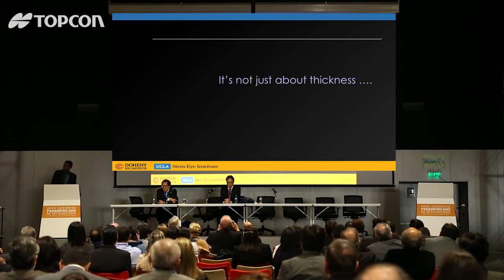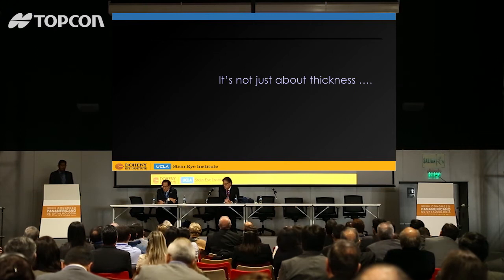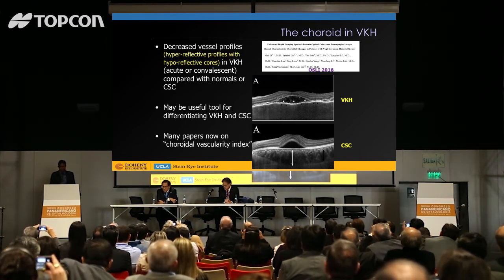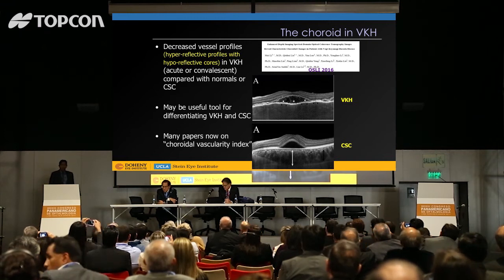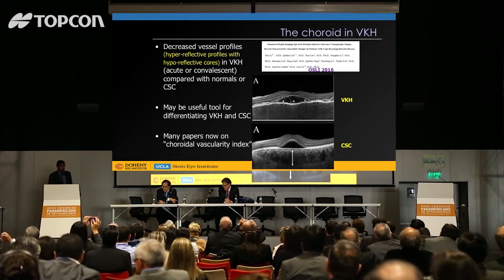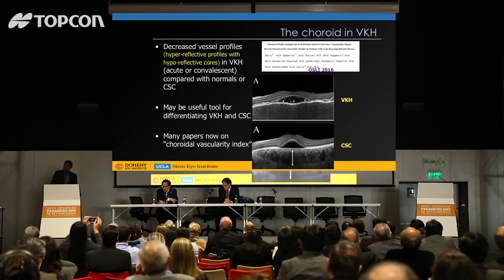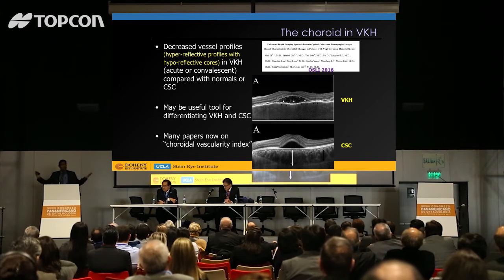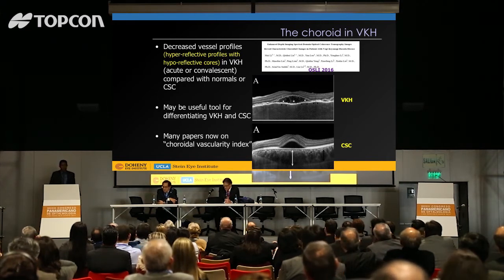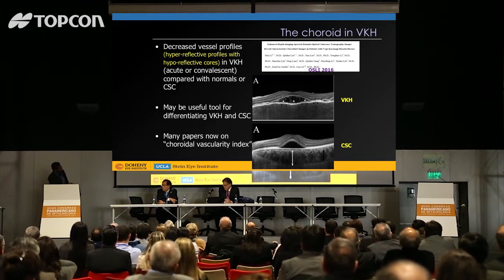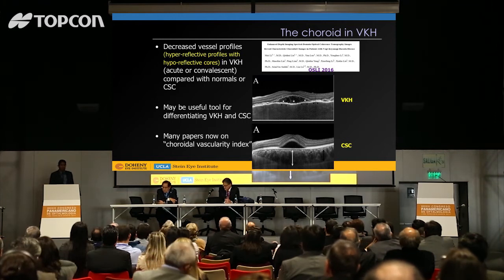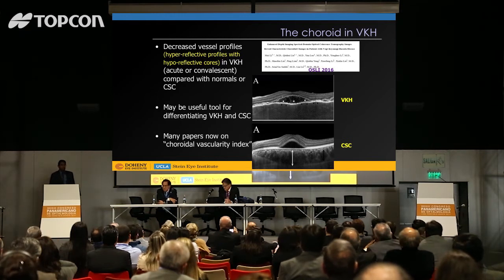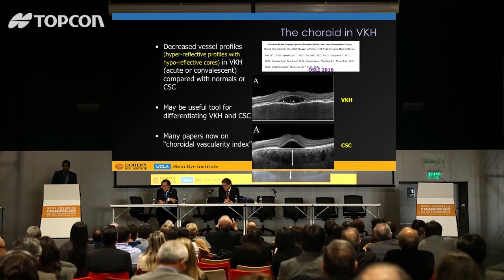One thing I want to emphasize is that there's more information in the choroid than just its thickness. We published a paper last year in collaboration with one of my fellows at Zhongshan Ophthalmic Center in China. Many of us have seen patients confused between Harada's disease and central serous choroidopathy — both can feature thick choroids, and you don't always see obvious inflammatory signs in every Harada's patient. The treatment is very different — you don't want to give a central serous patient steroids. The choroid looks quite different in these two entities. You can recognize the vessel profiles well in central serous patients, but they're often obfuscated and difficult to differentiate in Harada's disease, probably reflecting inflammatory infiltration. This can actually be measured quantitatively.